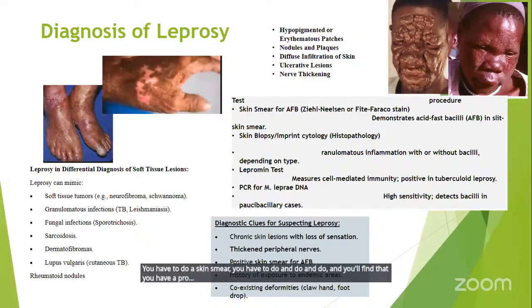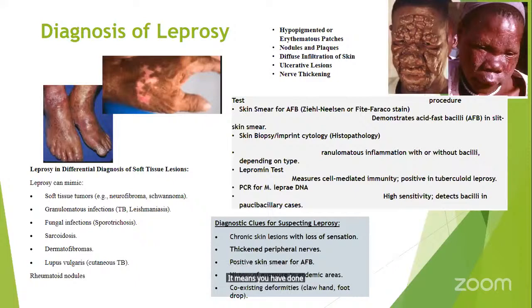You should never give a patient "no organism isolated" and you remain there. It means you have done zero work. Think further, what could be the problem? Because the patient cannot look like this with no organism seen. You can even refer them for histology so that a sample can be taken and processed. It will be easy for this patient to get the proper medication.